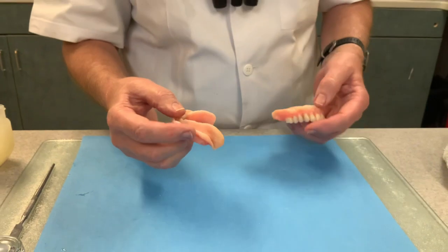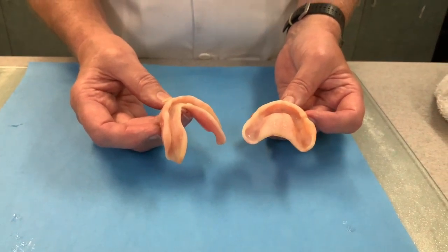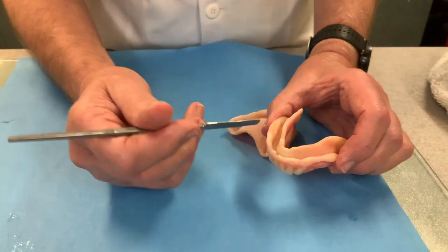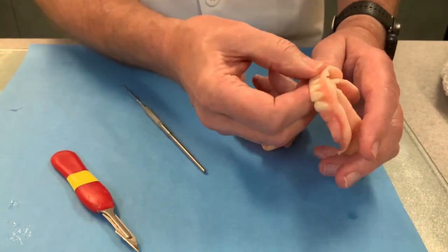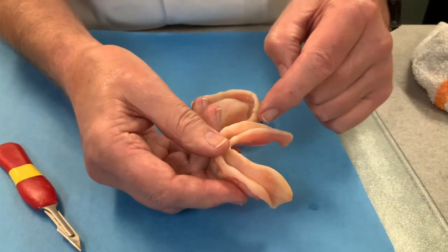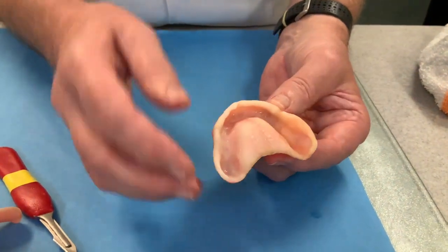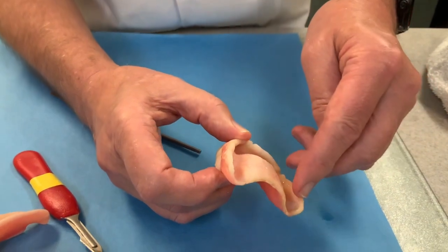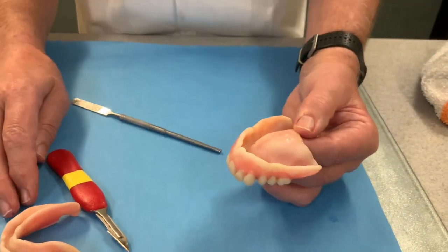We refreshed this last Thursday and the video of exactly how to do the refresh is on the Flowcast website. There are a couple things to notice — look at this little place right here. That wasn't there until we refreshed it; we picked up a little bit of border right here, and that median labial frenum has caused that. We also got a really nice border on the lingual now — you can see the S-curve. That S-curve is what's going to hold that lower denture down. On the upper it just resurfaced the whole inside. We picked up a nice border lateral to the tuberosity, and you can see the coronoid notch has been made on both sides. The refreshing process just makes the whole thing more accurate.